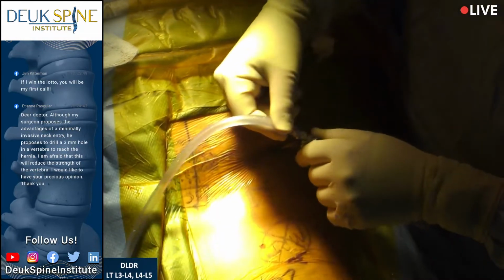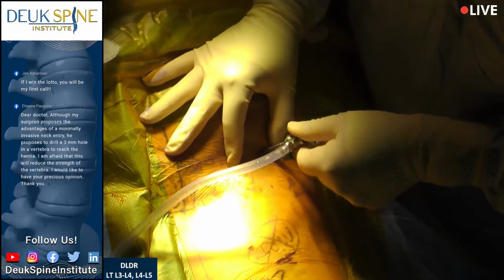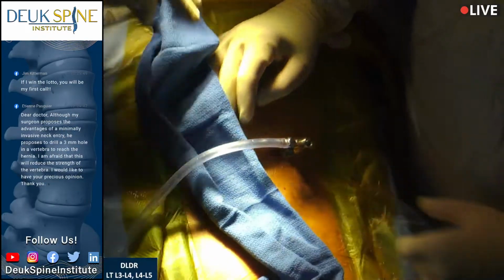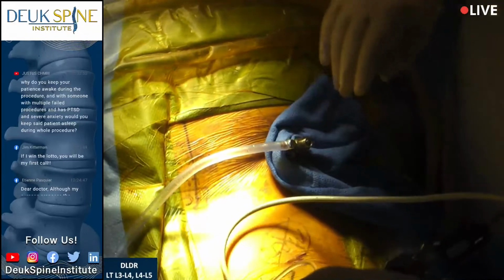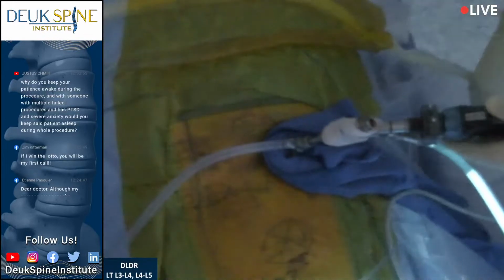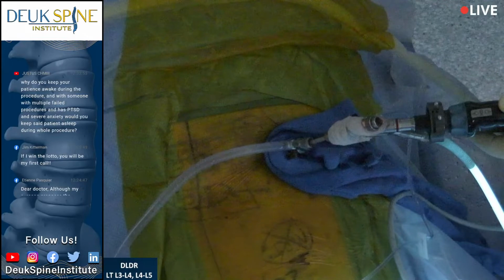So far, everything is going very well for this nice lady. Very excited for her to get out of pain. Yep, thank you. All right, you can see we have a tiny 1/4-inch incision. We're going to go in with the endoscope next to the next disc we're fixing, which is the L4-5. You can already see the disc right there.